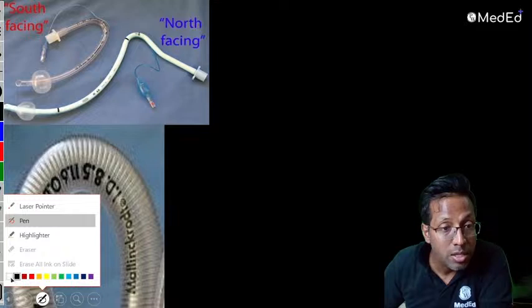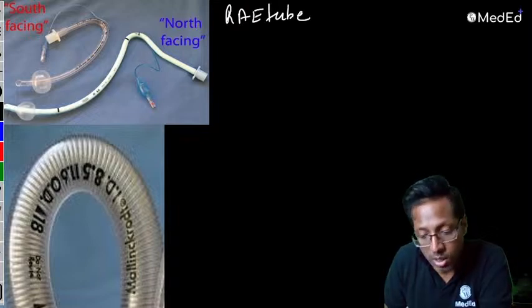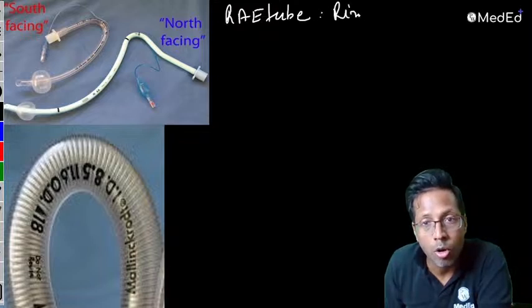Last year in FMGE this was given as one of the options. This is what is called the Ring Adair Elvin tube, RAE tube. In one of the questions, this was given as an option. It was not a direct question, but somewhere they had mentioned this as an option. So this is called the Ring Adair Elvin tube.